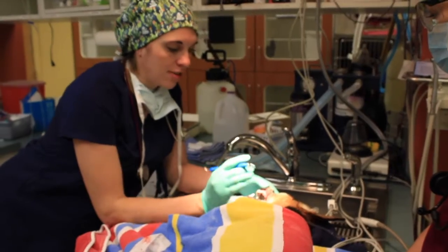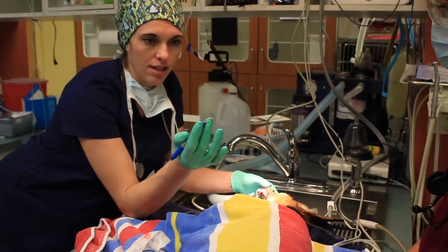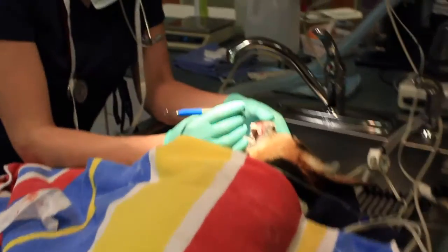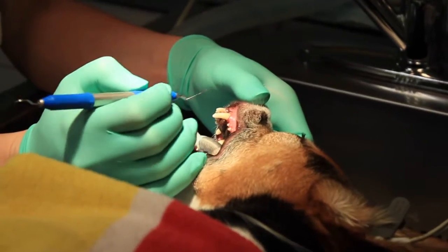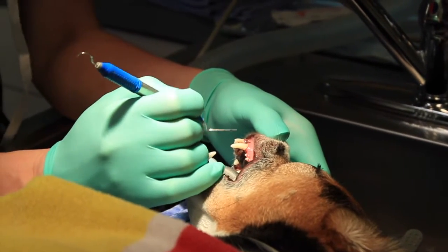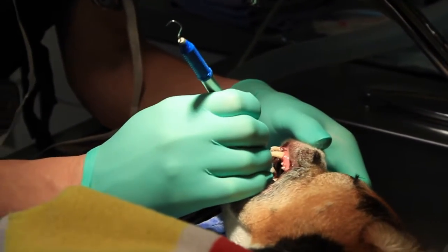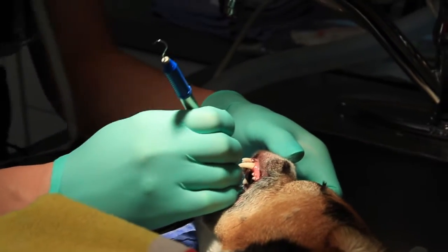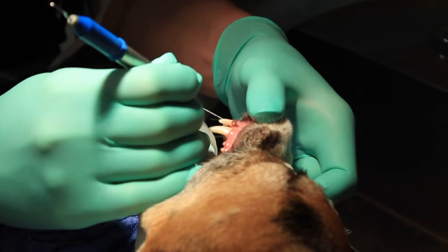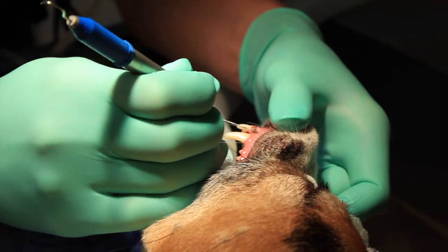After we've reviewed the dental x-rays and scaled the teeth, the next step is to go through and probe each tooth. We use this probe and go along the perimeter of each tooth, looking for pocketing, mobility, or any abnormalities that might indicate a tooth needs to be removed. As we go through we're also accounting for each tooth and making sure there aren't previously missing teeth or anything like that. We do it in a very systematic way so nothing gets overlooked. As we go, we have a dental chart so if any abnormalities are noted we can tell Brenna and she can add it to the chart.